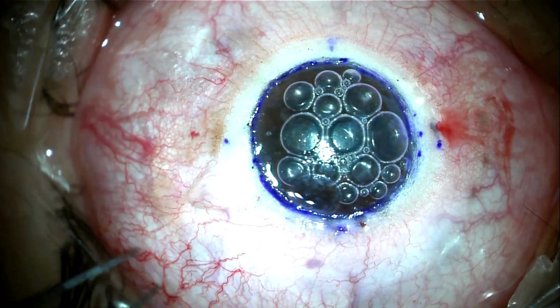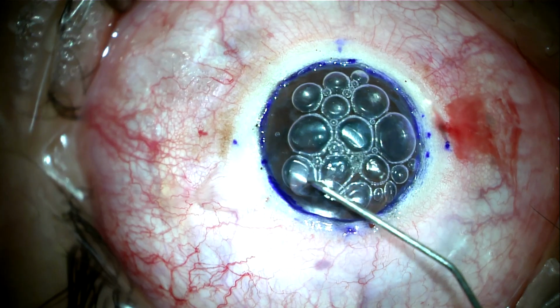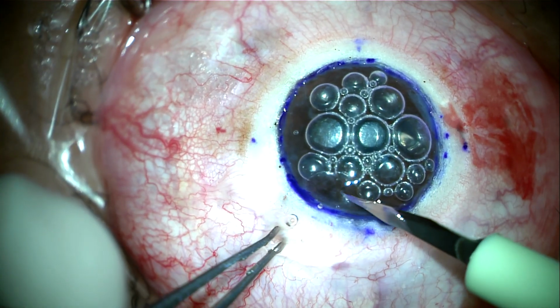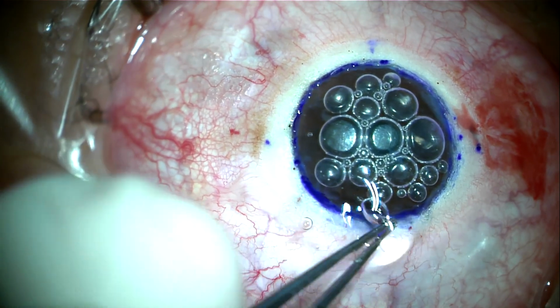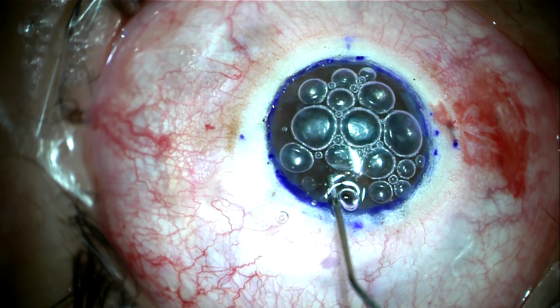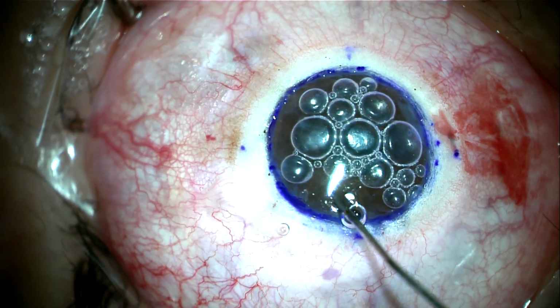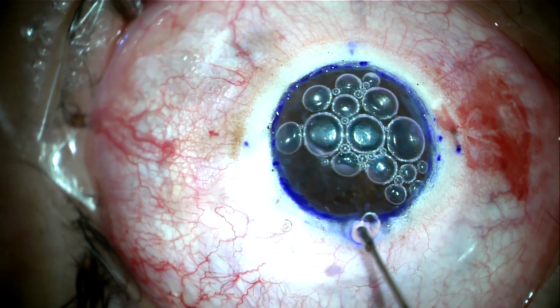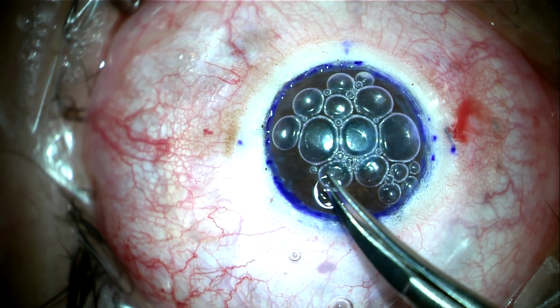A drop of viscoelastic is then placed over the bubble, followed by a gentle opening of the roof of the bubble and injection of viscoelastic inside the collapsed bubble to open the plane between the stroma and Descemet membrane. It is evident now that while we are injecting viscoelastic in the bubble, the AC bubbles are moved to the periphery, indicating that the type 2 bubble is now full of viscoelastic and not air.